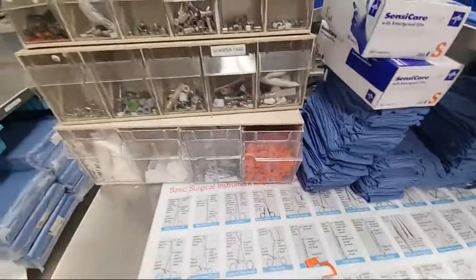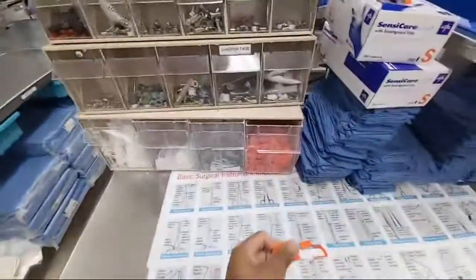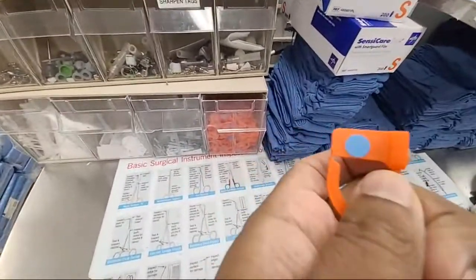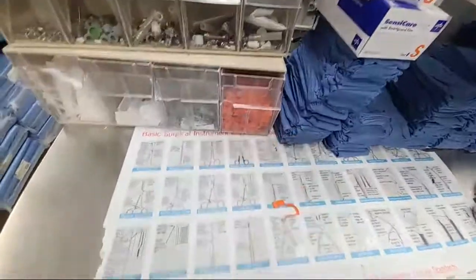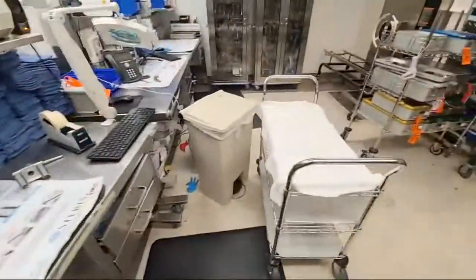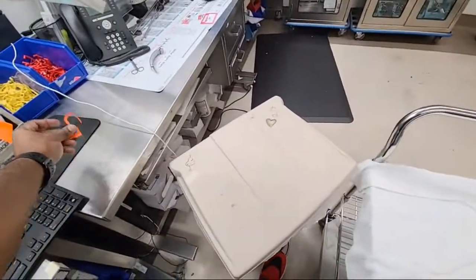If you accidentally, when you're carting them away, like on the cart over there, it hits a corner or a wall or something, that little tiny part will just snap, and no surgeon or surg tech should accept it with it open because it looks like it's been tampered with. So I'm going to throw away that one that I just used.